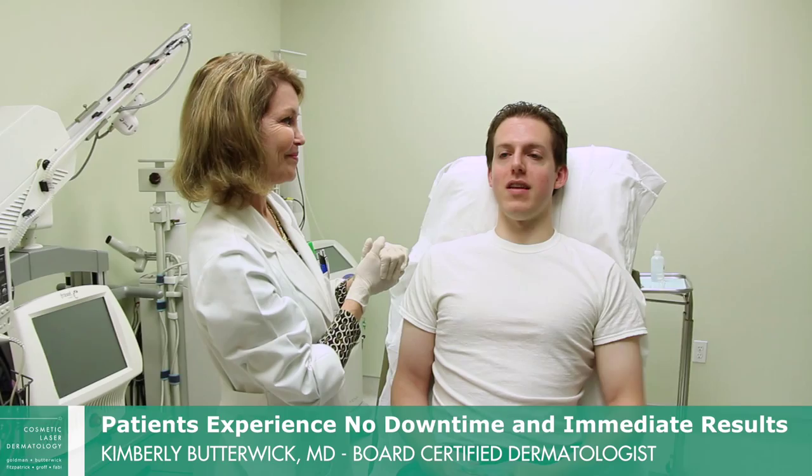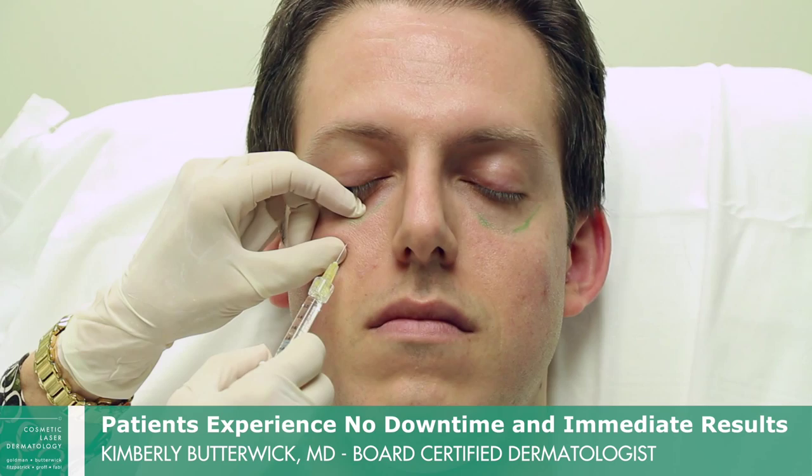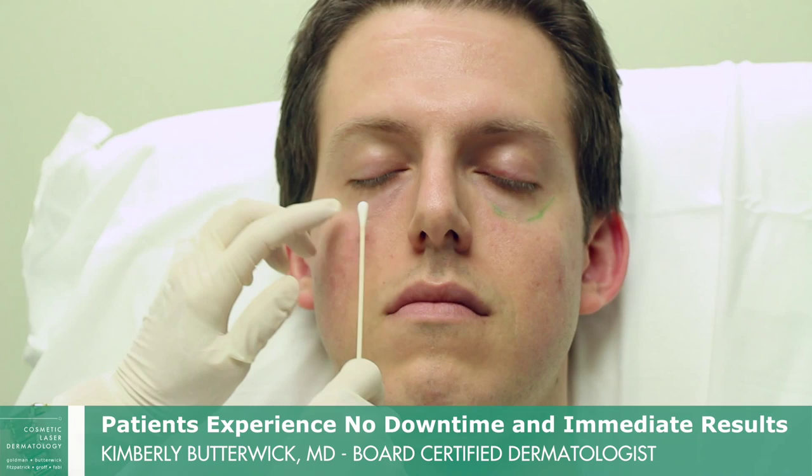How did it feel? It felt fine — very little pain, if any. In this area, the filler is placed very deeply because the skin is thin, and we don't want it to show. We want to place it very carefully in very small quantities.